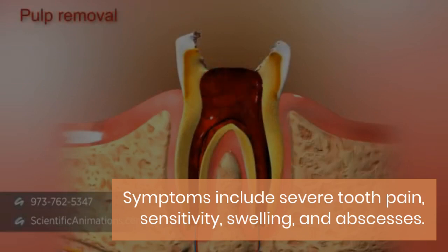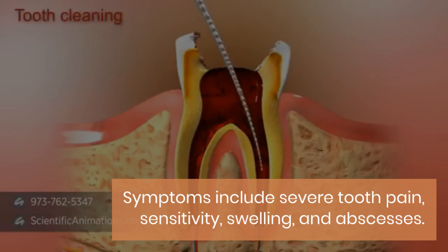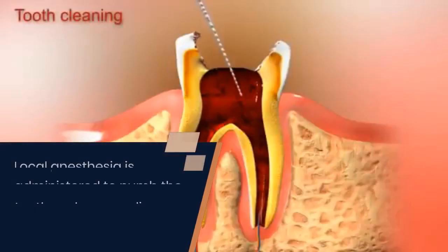Anesthesia. Local anesthesia is administered to numb the tooth and the surrounding area, ensuring a comfortable experience for the patient during the procedure.